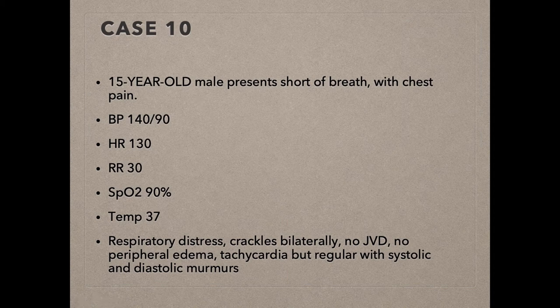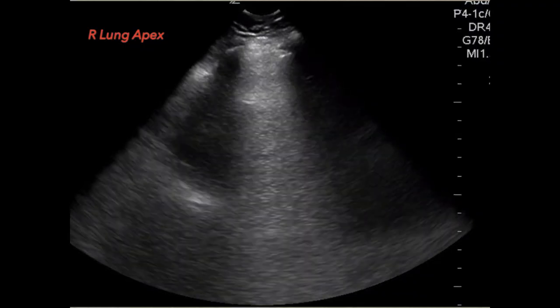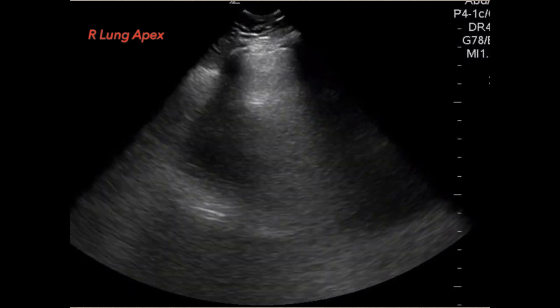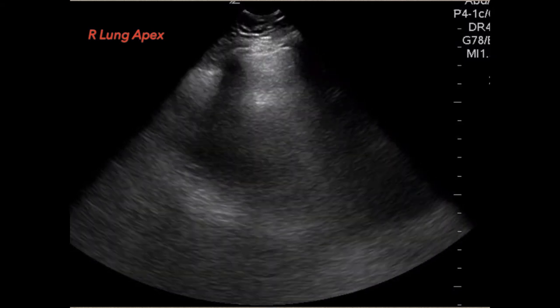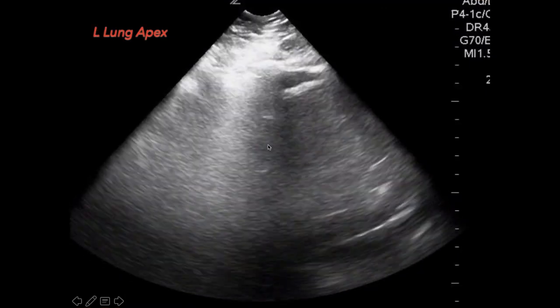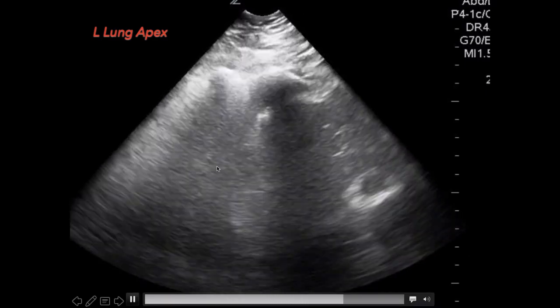Last case: a 15-year-old male presents with shortness of breath and chest pain. Blood pressure 140/90, heart rate 130, respiratory rate 30, SpO2 90%, temperature normal. On exam: respiratory distress, crackles bilaterally, tachycardia with regular systolic and diastolic murmurs, no JVD, no peripheral edema. This is a real patient who came to UC Davis. Right lung ultrasound shows the pleura is up, no pneumothorax, and lots of B-lines. Left lung apex also shows B-lines throughout.